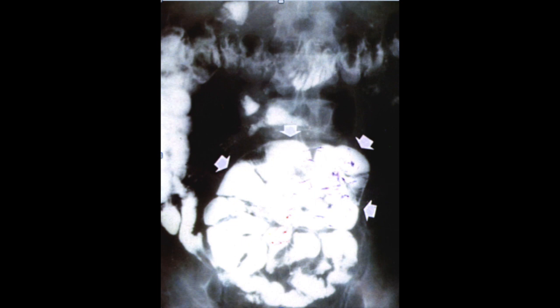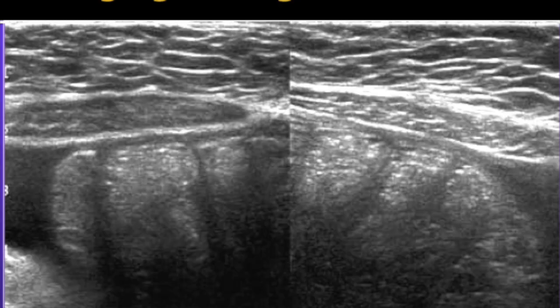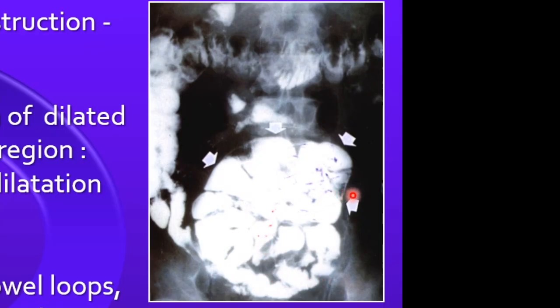Coming to the imaging features. On plain radiograph, features of bowel obstruction are seen with dilated bowel loops and air-fluid levels. On barium studies, a serpentine configuration of dilated small bowel within the cocoon is seen, leading to the cauliflower sign with proximal small bowel dilatation and increased transit time. On sonography, multiple confluent small bowel loops are seen encased in a thick hypoechoic membrane made visible by minimal ascites, with bowels arranged in a concertina shape with a narrow posterior base.